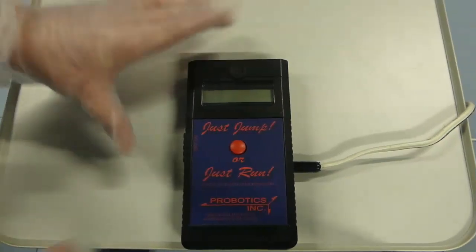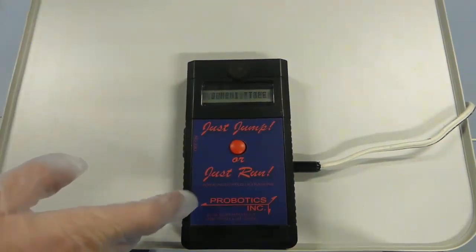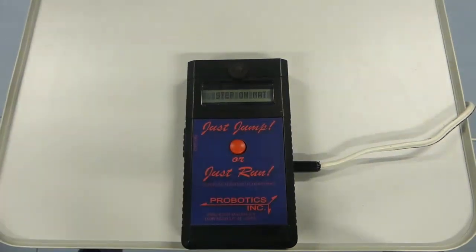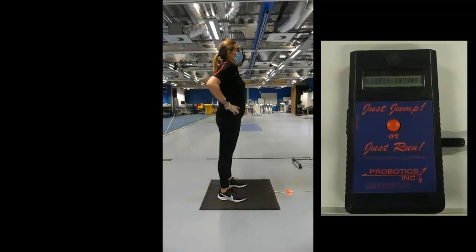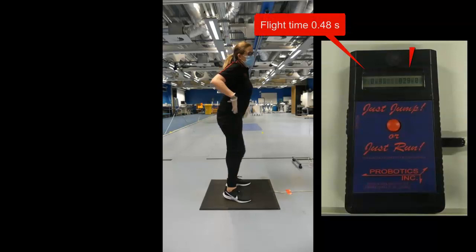To switch on the handheld unit, use the slider at the side to slide it on and it will scroll through some options. Select jump one time using the red button and it will tell you to step on the mat. Once you have stepped on the mat, it will tell you to just jump and then provide you with both flight time and jump height.